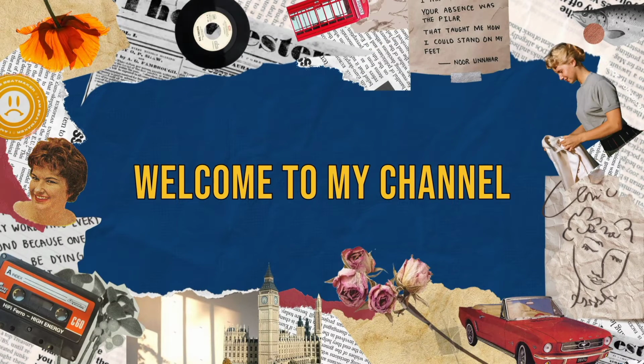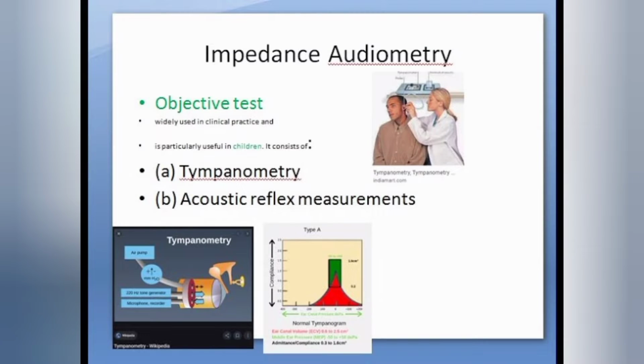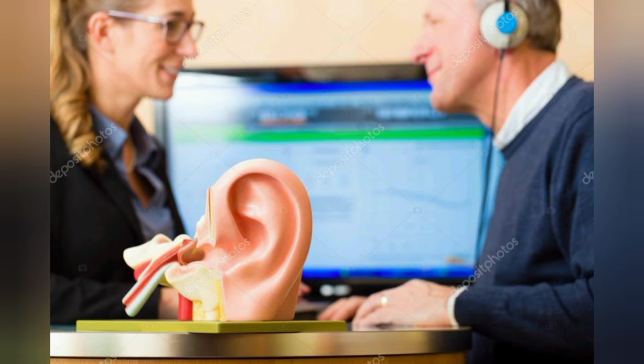I am Prachi. Today we are going to discuss impedance audiometry. Impedance audiometry is an objective assessment method of the working of the middle ear. Before starting about this test, let's learn about the ear.